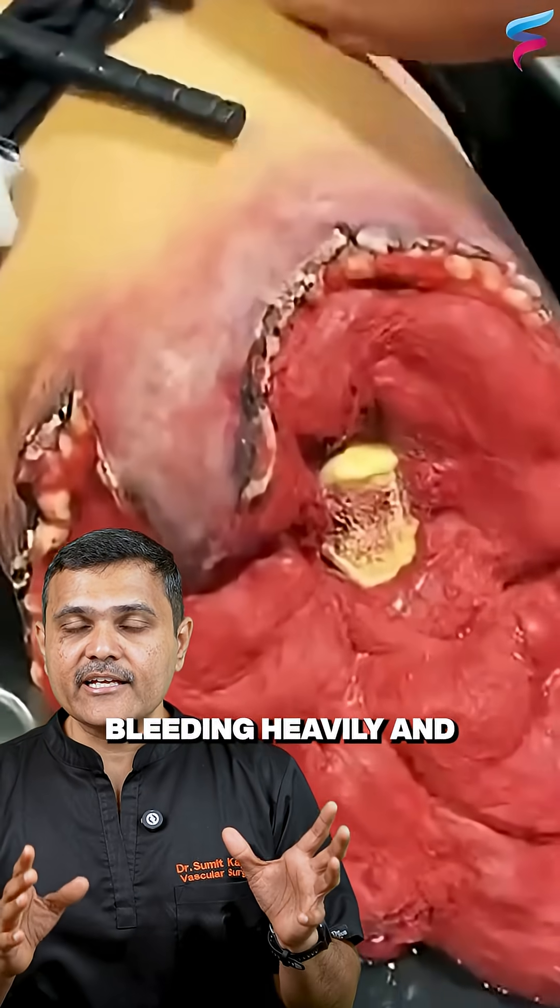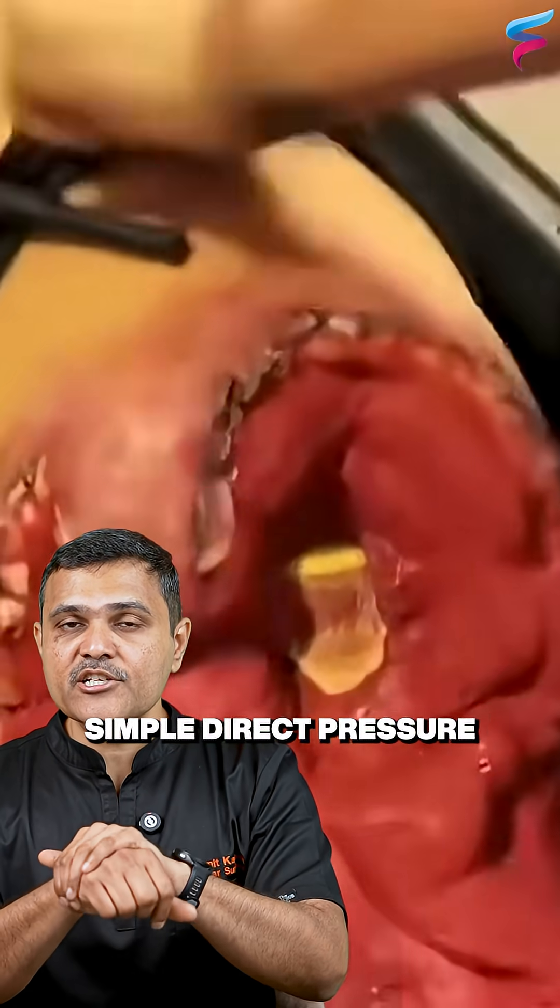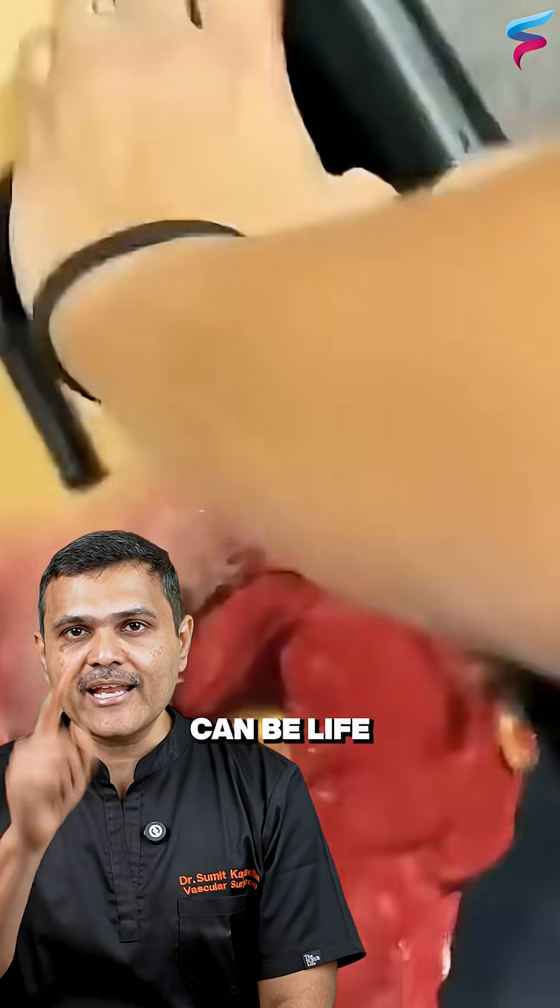When someone is bleeding heavily and simple direct pressure is not enough, a tourniquet can be life-saving.